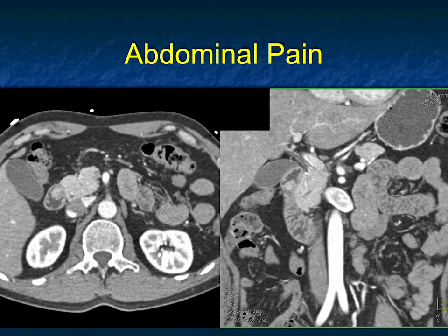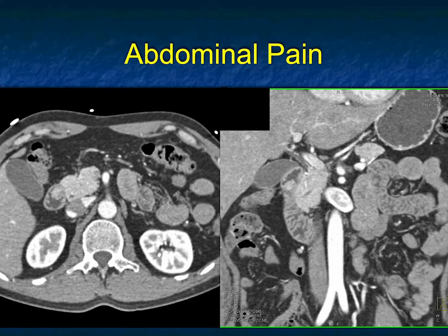Mesothelioma has been linked to toxic exposure to pollutants, particularly asbestos, and it could occur in the abdomen for that reason as well. In this patient with abdominal pain, two images show a vascular lesion in the duodenum, roughly the first to second portion. The mass is about one and a half centimeters and slightly vascular. For duodenal lesions I first think about carcinoid tumor and GIST tumor — both are vascular and occur in that location. You can also have polypoid lesions or duodenal polyps.